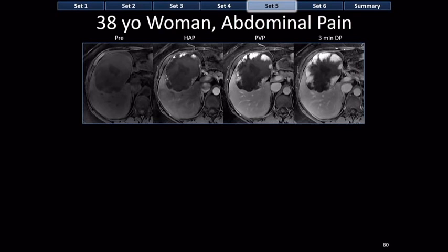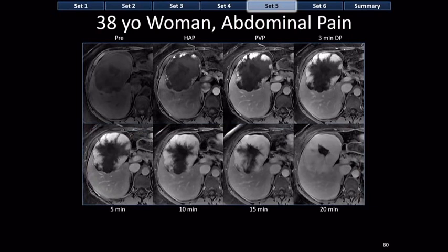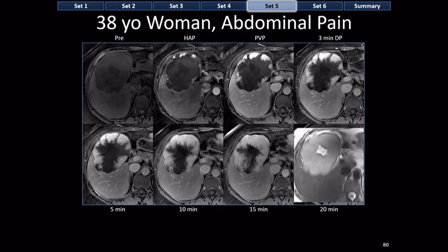With additional imaging at 20 minutes, the hemangioma fills in completely except for a central area of non-enhancement. This has been called a central scar, but hemangiomas don't have central scars — this is an area of liquefactive necrosis or cystic degeneration. On T2-weighted imaging, the center is super bright — liquid bright — proving it is liquid, not a central scar. Hemangiomas might have areas of cystic change, and the outer part is not light-bulb bright because they contain fibrous stroma as well as blood spaces.